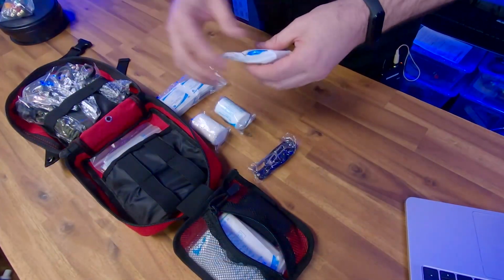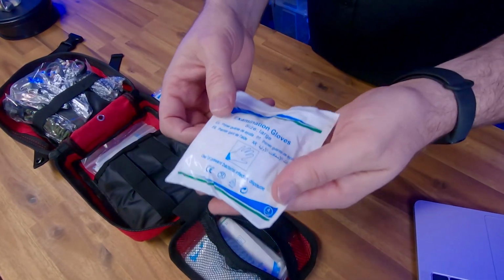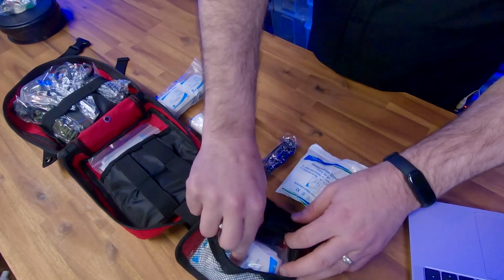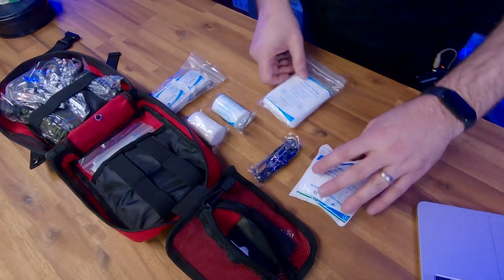It doesn't have emergency water, but again, you can get some that do. It's going to have your standard exam gloves. I can't tell you how important this is today. You don't want to get somebody else's cut or wound infected. This is an exam glove that you can throw on quickly that's sterile. Triangular bandages. So that's yet another one.